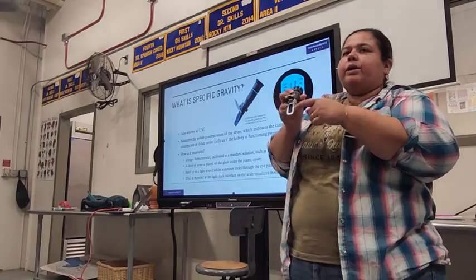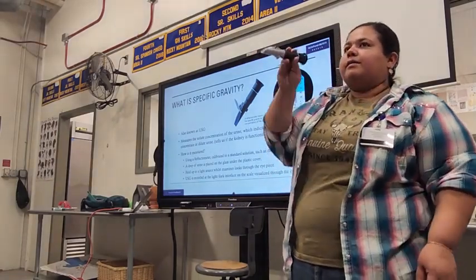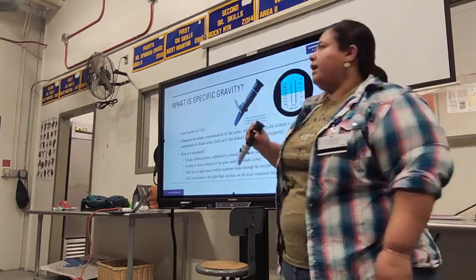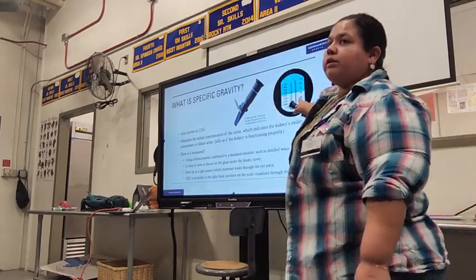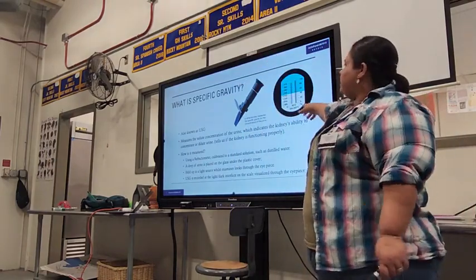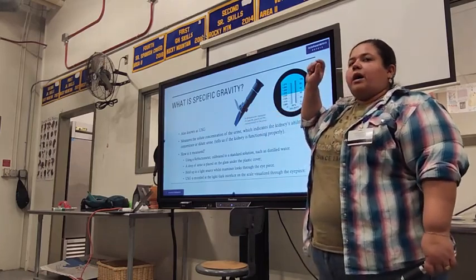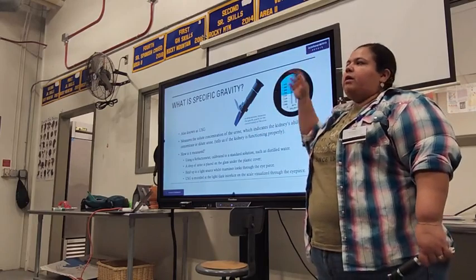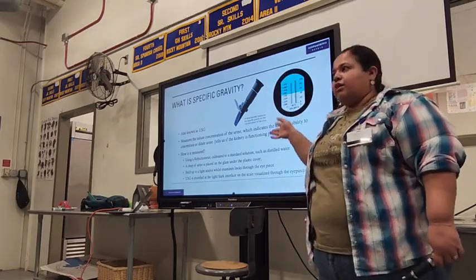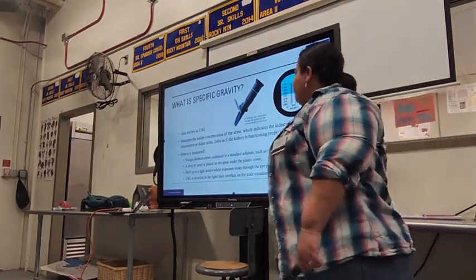There's a glass window here, and then there's this plastic cover. It's like a telescope or a monocular, and you look up through it, and you can see a scale in there. That scale will look something like this. There are different refractometers with different measurements. This one is salinity. We're not using that one. Ours is going to say urine specific gravity, or urine SPG, or USG, okay? That's what ours are going to say.